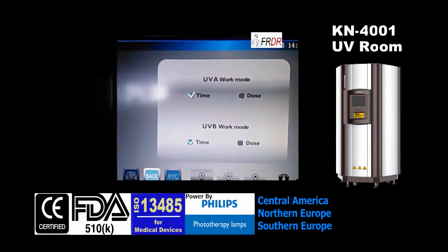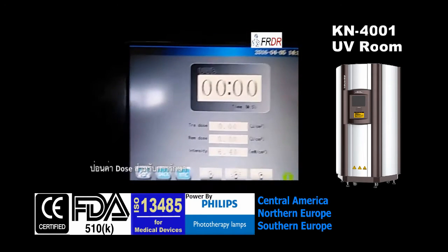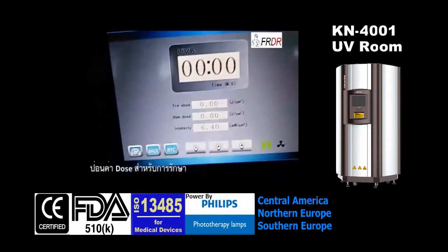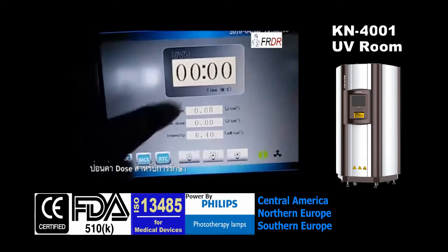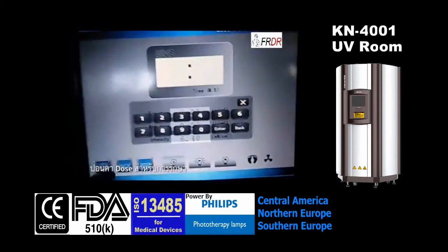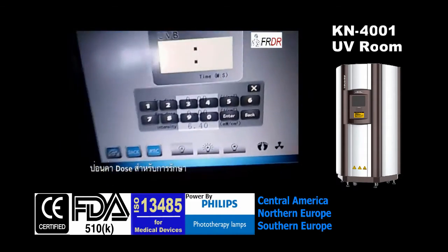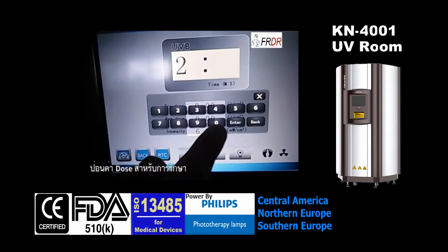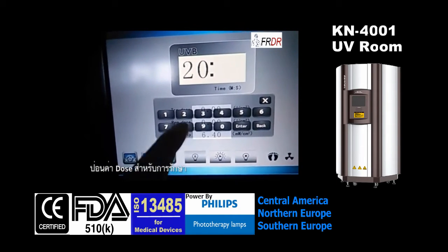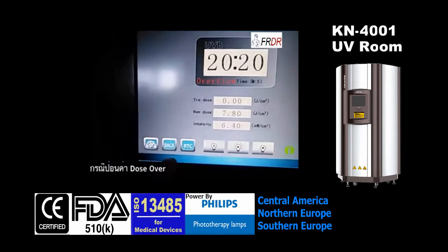Now I'll show you how to start this machine. This is the UVB UV light inside, and this is under timer mode. We input the time — 20 minutes and 20 seconds — and press here.